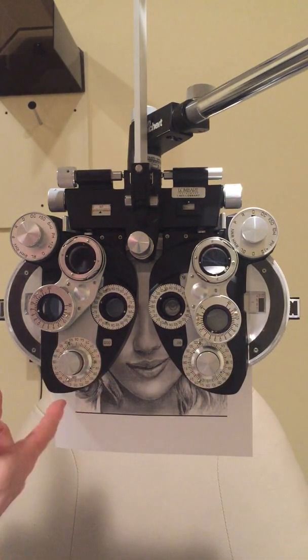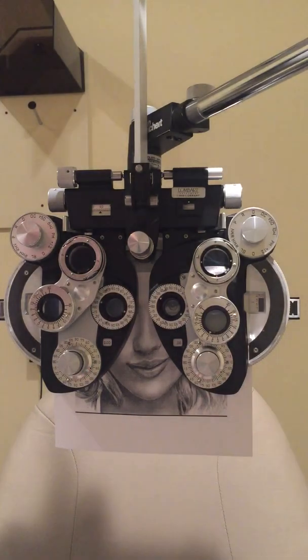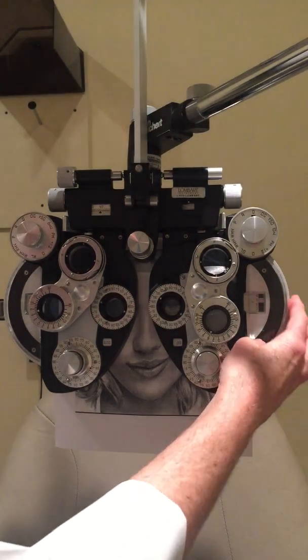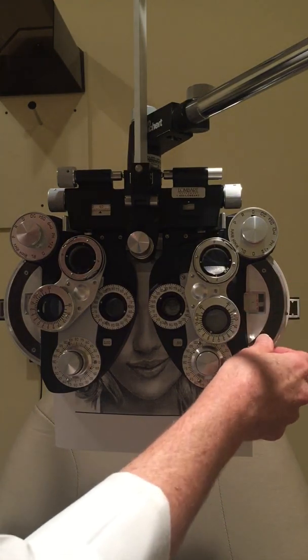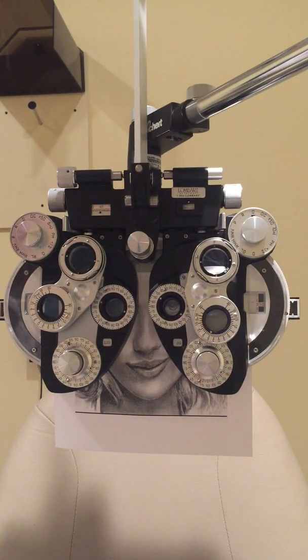I ask her to read the smallest line she can guess at. She's getting some letters on the 20/30 row. I check whether she needs more or less minus starting from her old glasses. She prefers less minus consistently. After reducing, I check again and she's now around the 20/25 row — better than before. I'm now ready to check for astigmatism in the left eye.